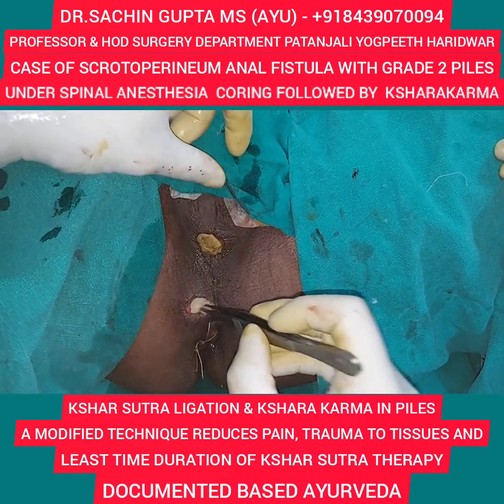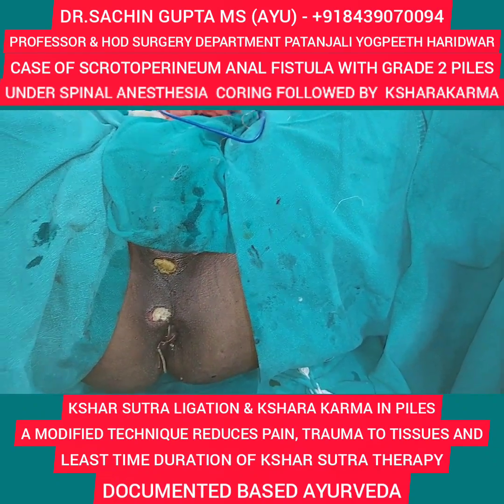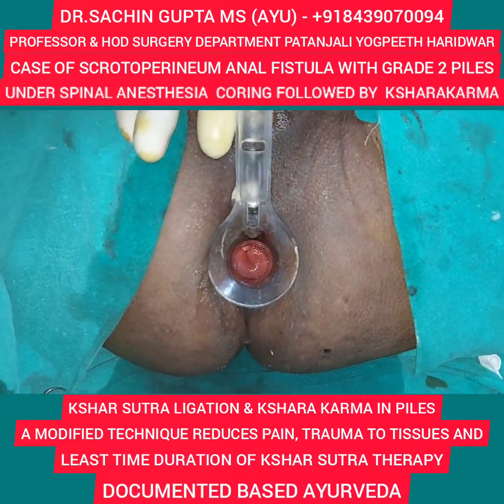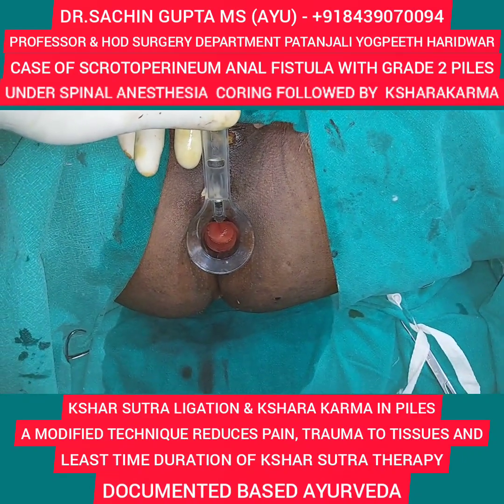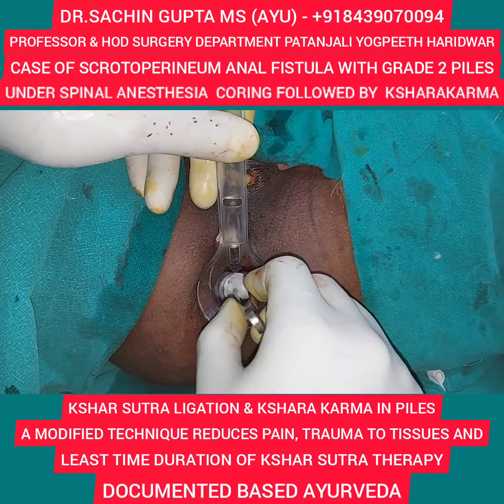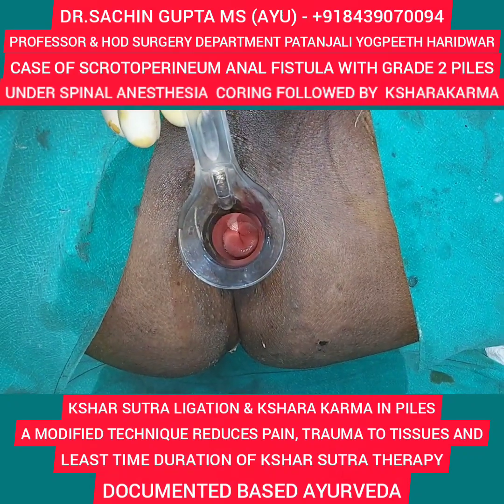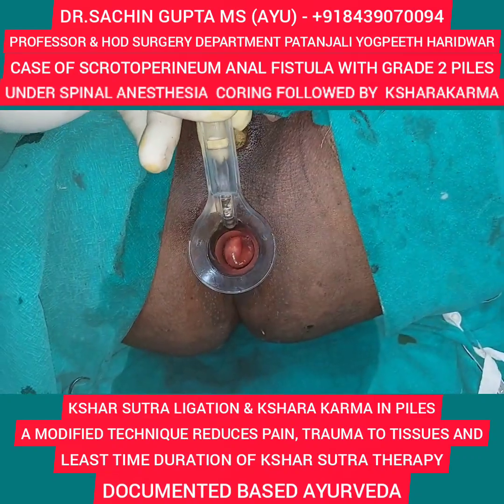Now next is the swab test to check the anal canal for any bleeding or any oozing. I have introduced my proctoscope inside. I'll take the plain gauze piece to confirm whether there is any bleeding inside. So you can see the screen. So there is no bleeding inside.